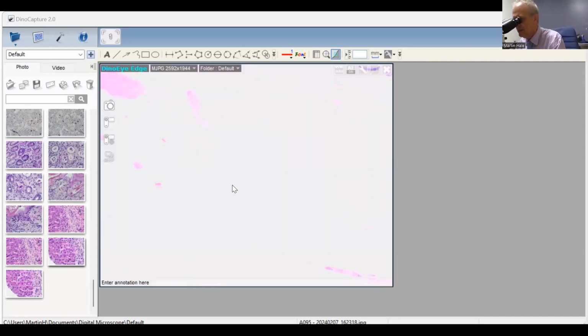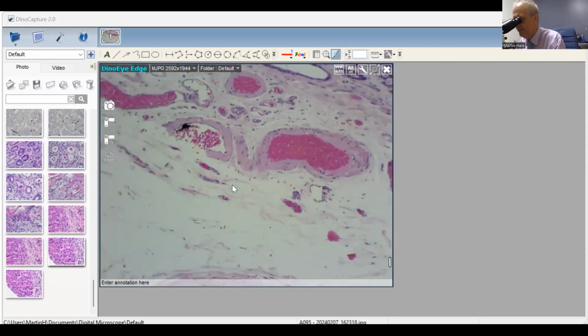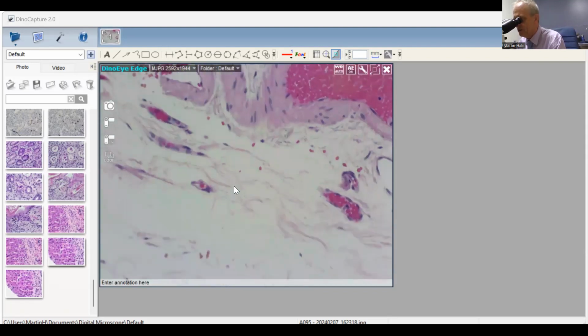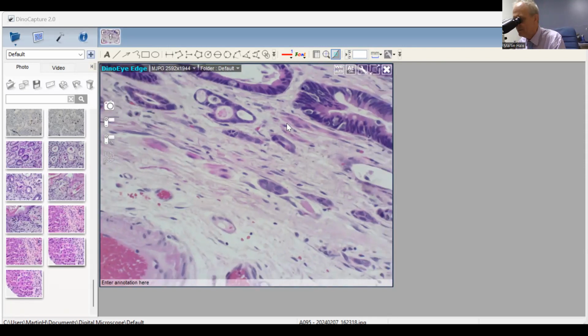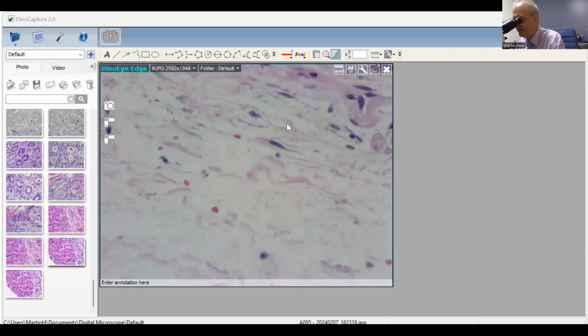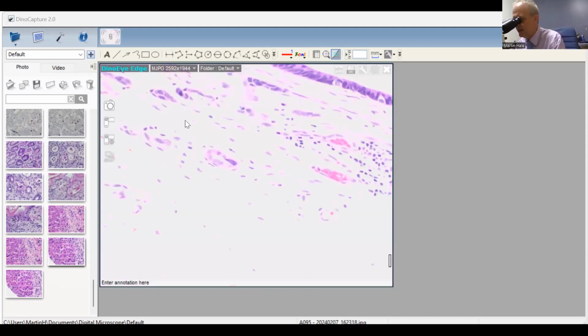So this remains a T1A. It's only just a T1A. There's a tumor island there, but there are slips of muscle just there. But you can see how close it is. And there again, you can see tumor there, and then these slips of muscle just infiltrating. I mean, this is just a T1A.